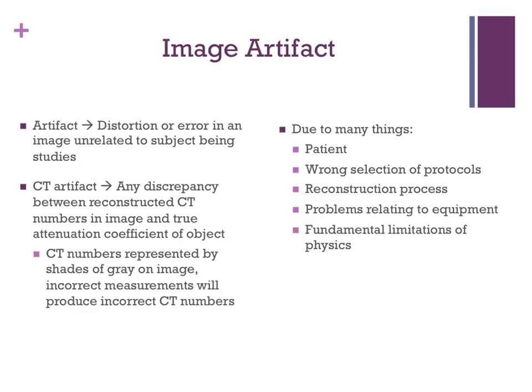As we know, artifacts can degrade image quality, affect the perceptibility of detail, and even lead to misdiagnosis. Obviously, this can cause serious repercussions to the RADs. It can even lead to malpractice suits. An artifact is a distortion or error in an image unrelated to the subject being studied.